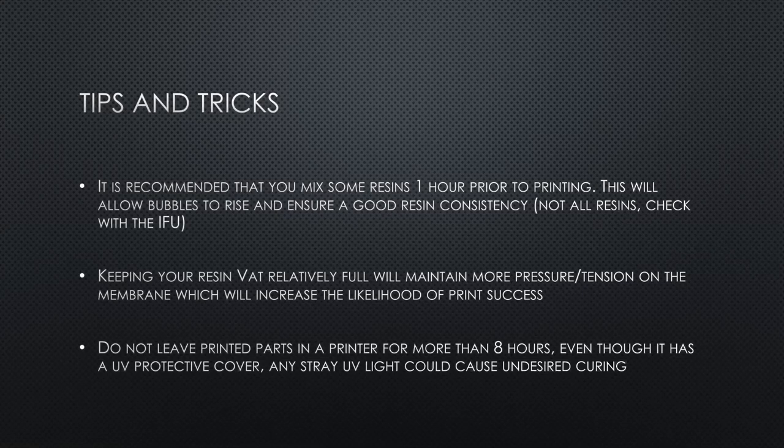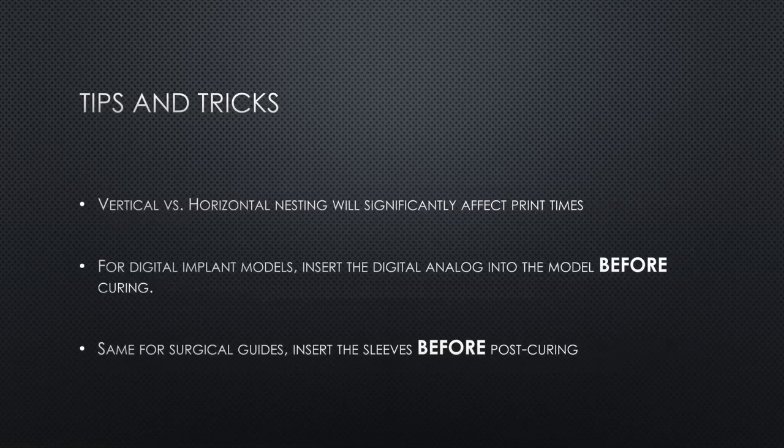As for nesting and orienting your 3D printed parts, that will significantly affect your print times. It's especially noticeable for laser SLA printers because the prints are happening one layer at a time, being drawn, like I said, like a pencil. So if you place an object vertically, that increases the layer count exponentially when compared to a horizontal orientation. What I typically do is run a batch of small jobs throughout the day, printing flat to the build platform as much as I can, and then doing a large vertical print job overnight.